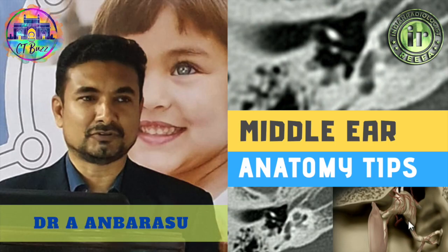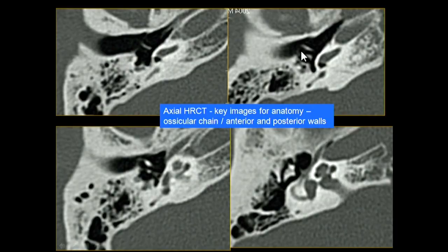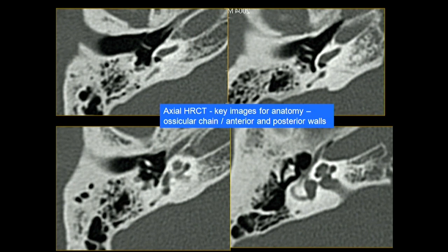The key images on temporal bone CT are the handle of malleus, long process of incus, neck of malleus, lenticular process, incudostapedial joint, and the malleo-incudal joint. Note this particular gap and the classic ice cream cone appearance. These four images you can see in every single temporal bone — zoom in on one side, scroll through, and you will be able to see it every time. That is good enough to confirm the ossicular chain is intact.